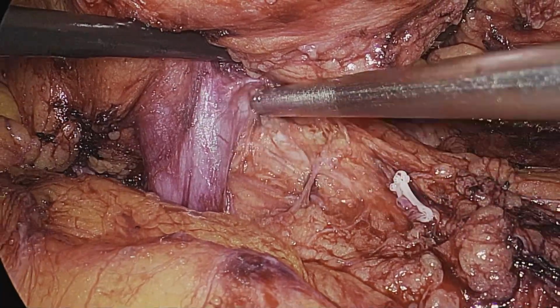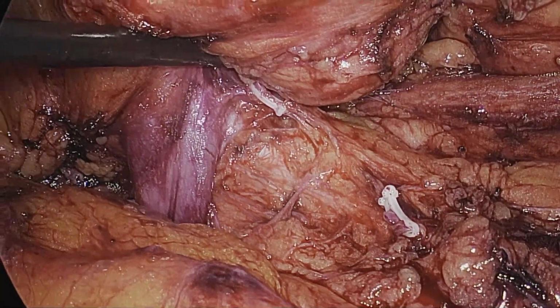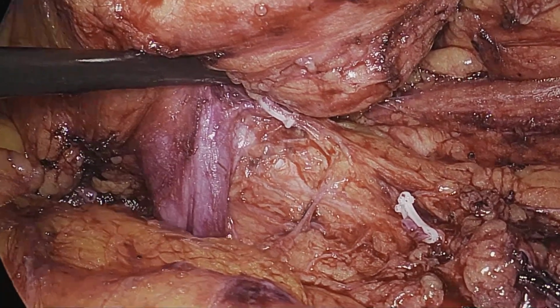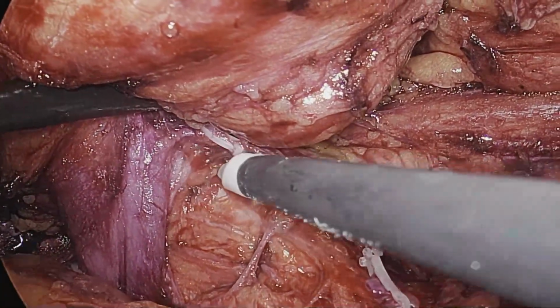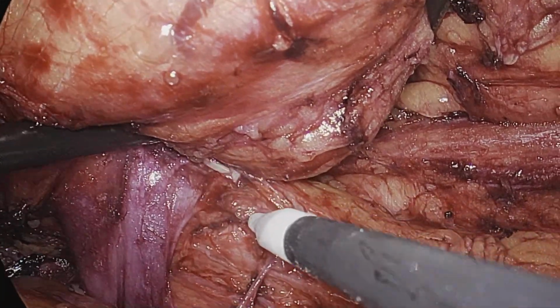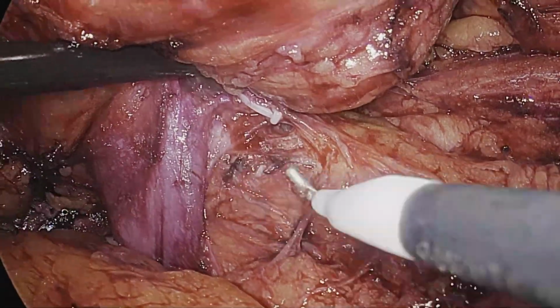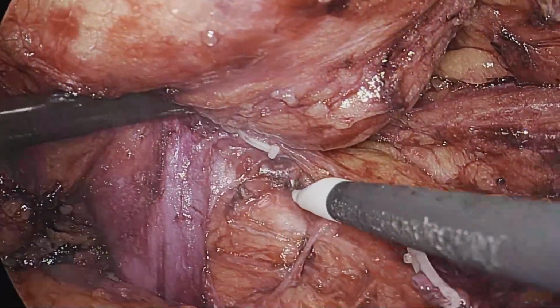This area is showing very high pulsation. Most likely, the renal artery is behind this fat. So, we are turning our attention to dissect this area. A hook is a very good instrument to work around here. The lymphatic strands can be cooked very well, and the artery behind it can get in view.